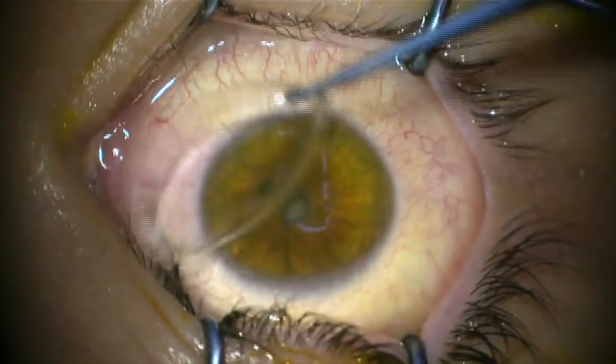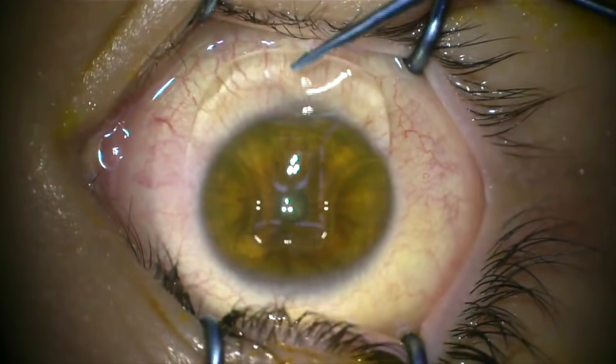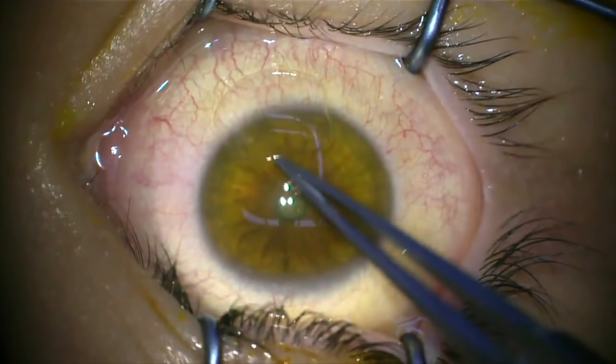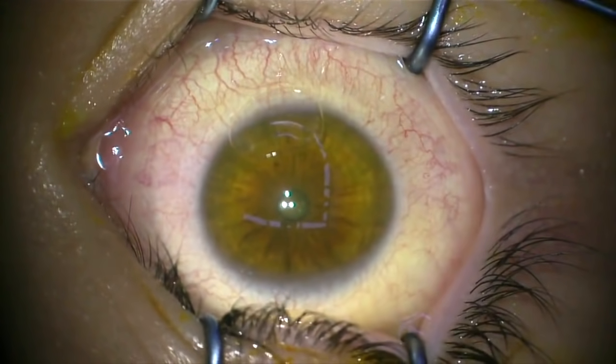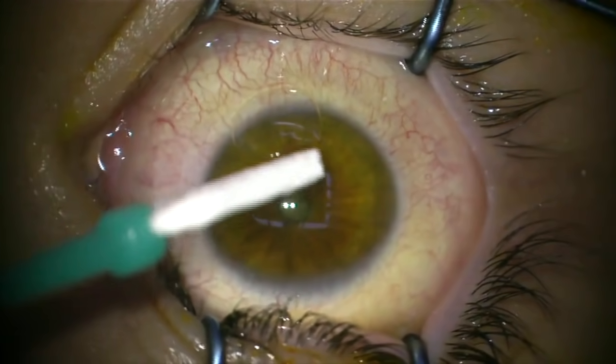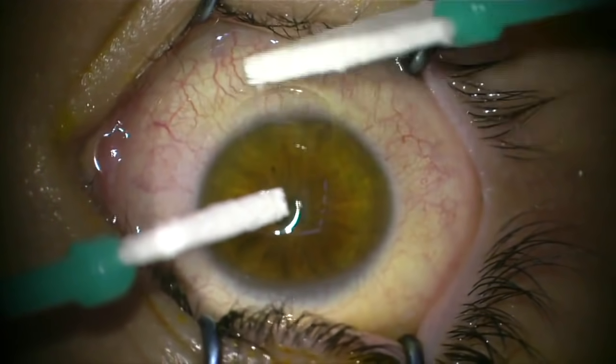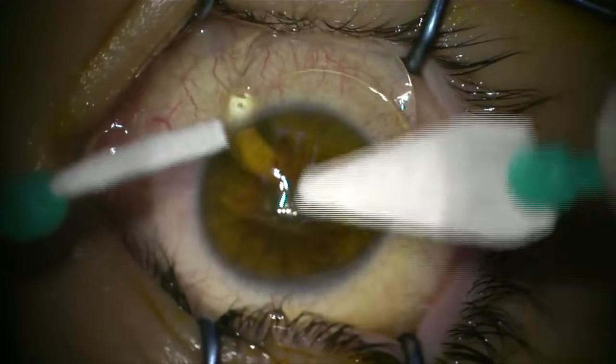At the end of the procedure, we will put some antibiotic and some anti-inflammatory eye drops on the eye, and also a special eye drop that promotes the healing of the corneal epithelium to significantly shorten the period of time the patients are uncomfortable for. You should really expect your eye to be quite painful for approximately two days after the procedure, and after that time, you really recover quite quickly.